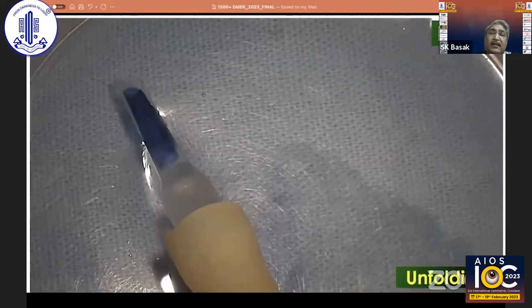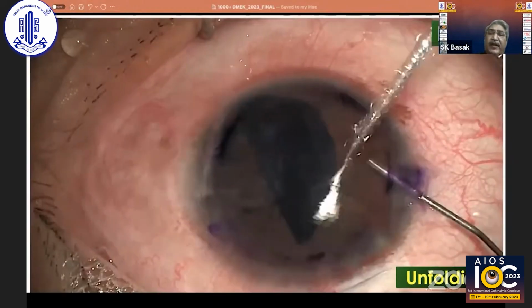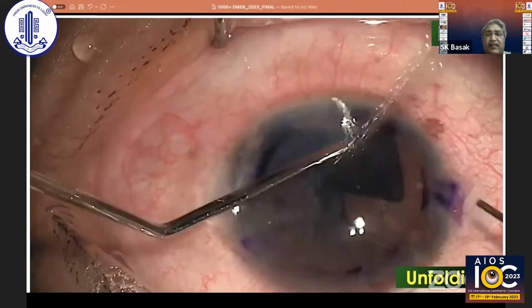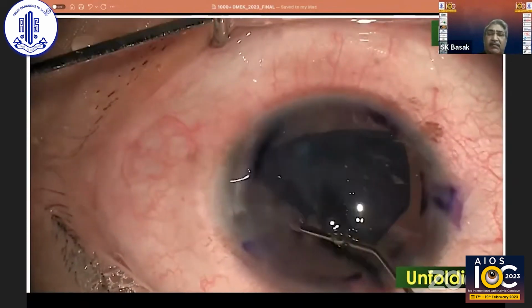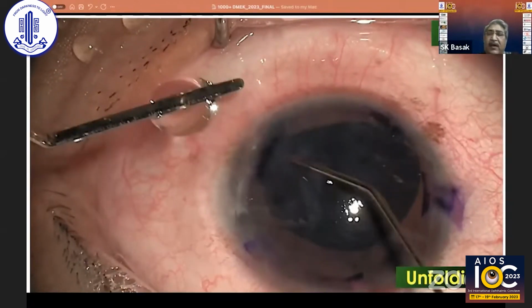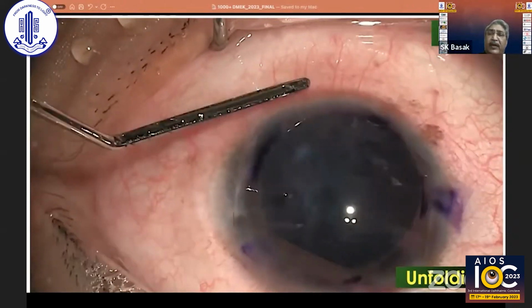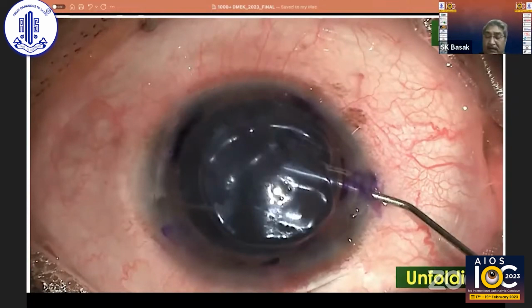And that unfolding, when you go all the way with your procedures day by day, in a typical scenario you can redo the same procedure: you pin one side of the periphery and dip in the chamber, and with one-hand or two-hand techniques or a little tapping on the dome of the cornea, you can unfold the whole tissue and gradually center it. A little bit of fluid injection and fluid egression is important. When you are totally fine with the centering, you go right up to the center and give an air bubble.